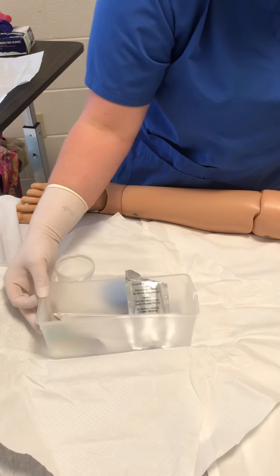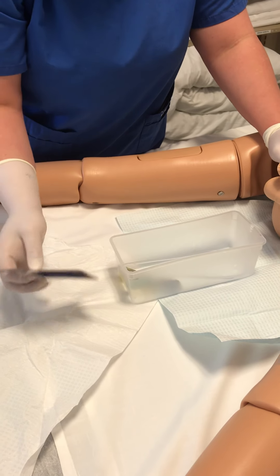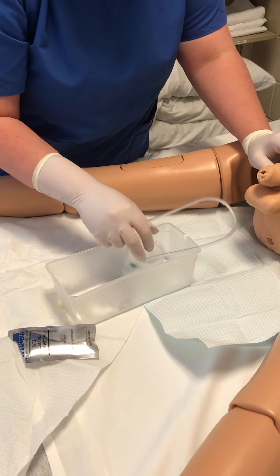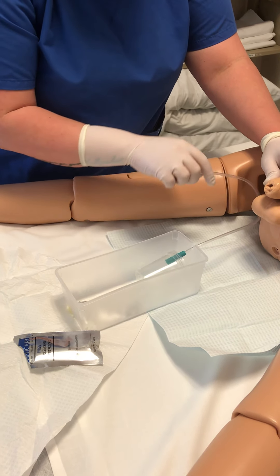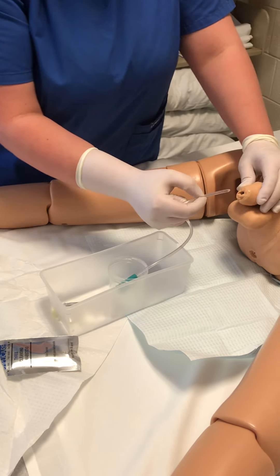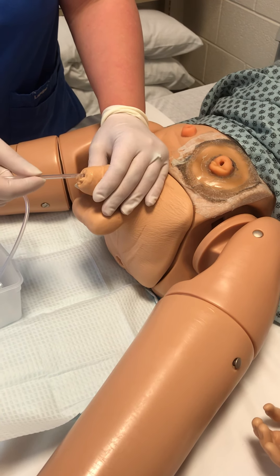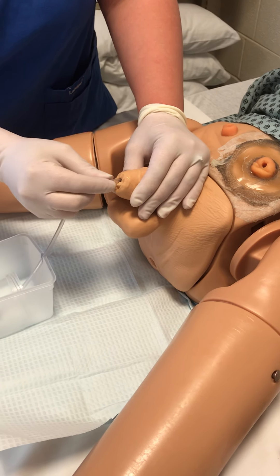Now I'm going to scoot this up, set my cup here, and place the end of the catheter right here — this hand is contaminated. Now I'm going to insert the tip of the catheter into the urethra. I'm going to ask the patient to bear down and they're going to feel some pressure. I'm going to insert it until I get urine, and once I get urine, I will go another couple centimeters.